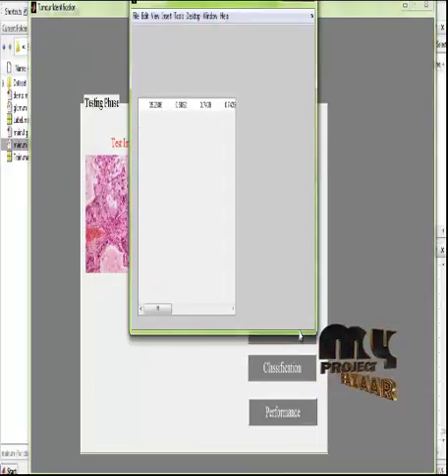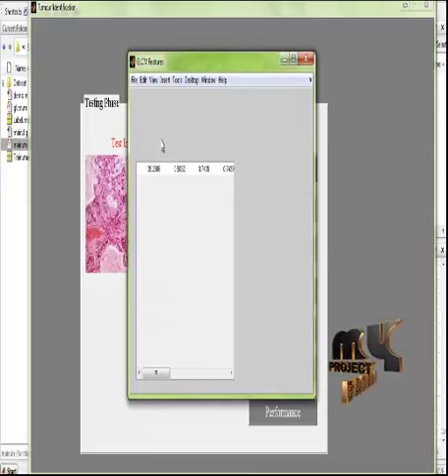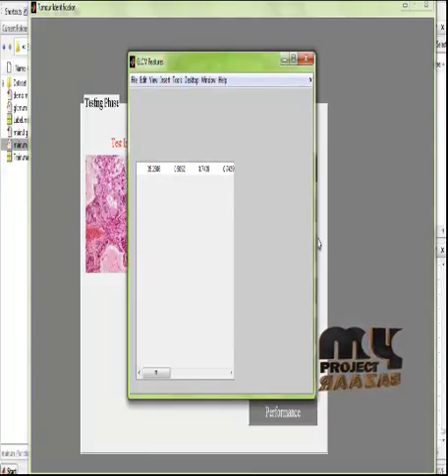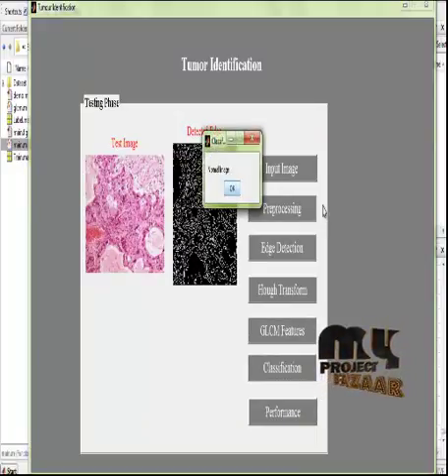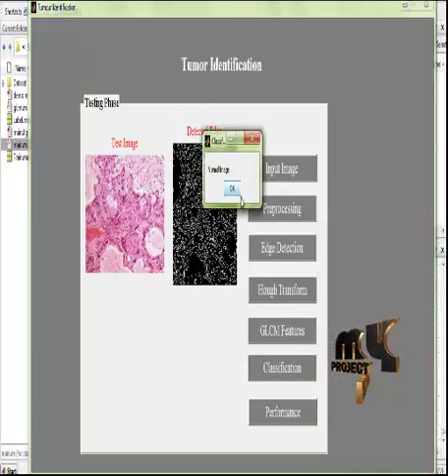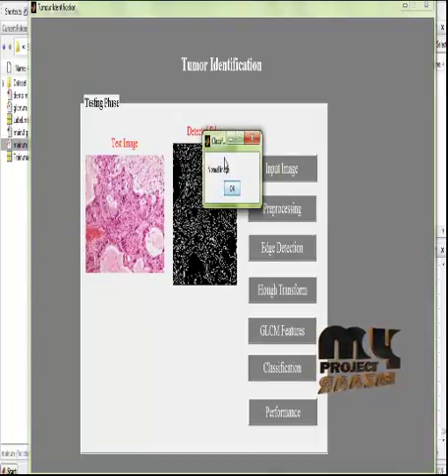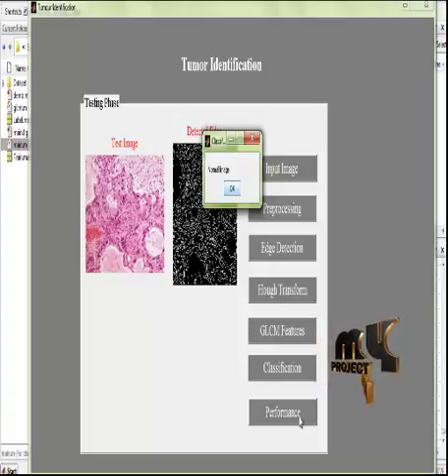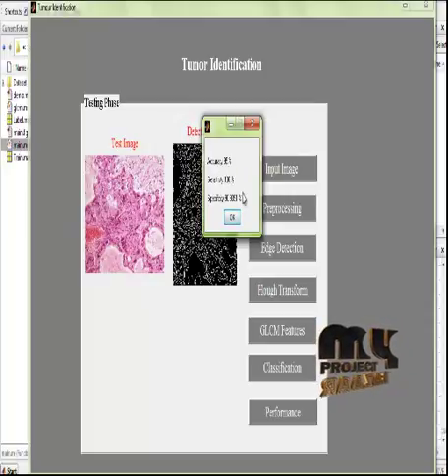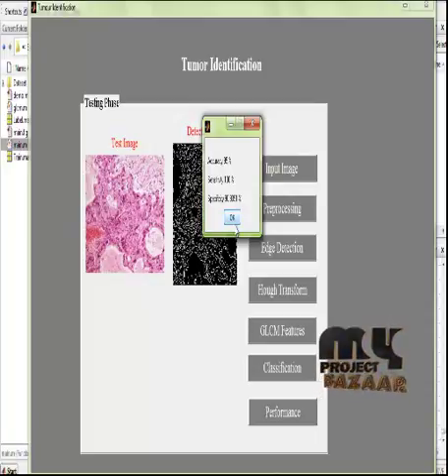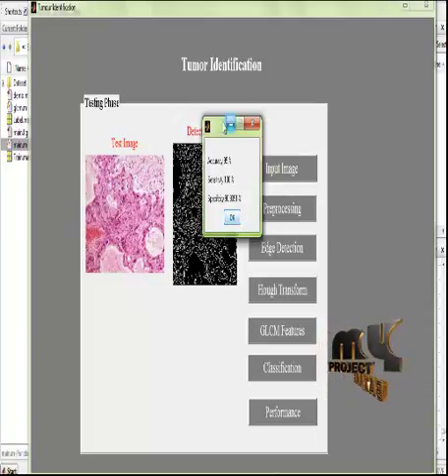After that, the GLCM features are extracted — these are the texture-based features retrieved from the input images. The input signal is then classified; in this case, the image is classified as an abnormal image. This classification is performed using the ANFIS classifier. Finally, the performance of the process is measured, and the accuracy, sensitivity, and specificity are obtained and displayed.